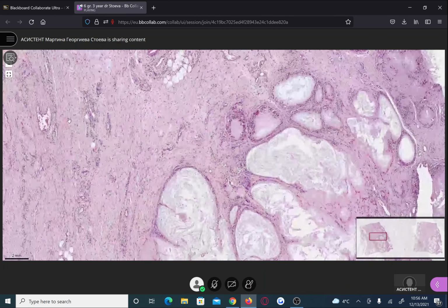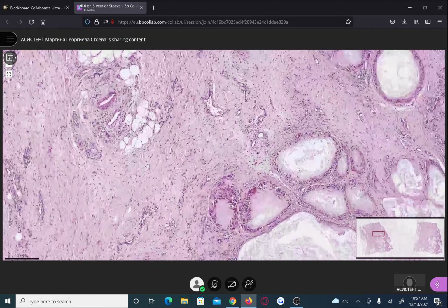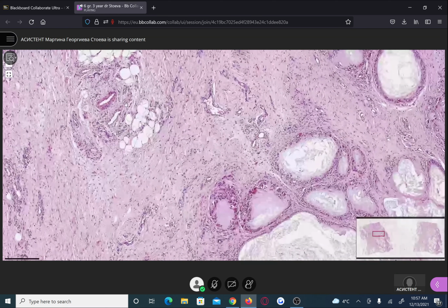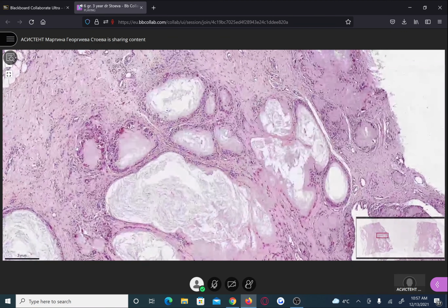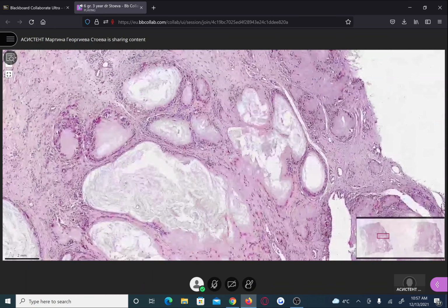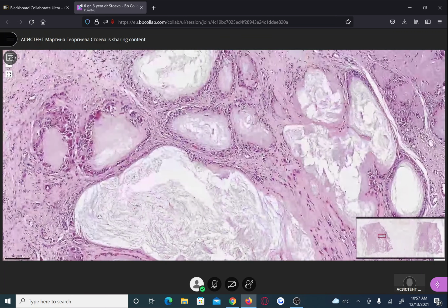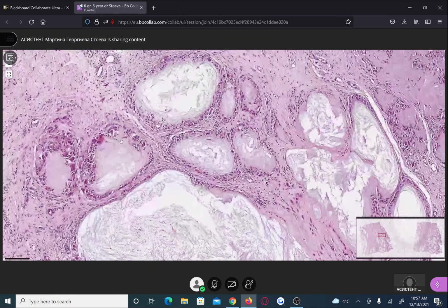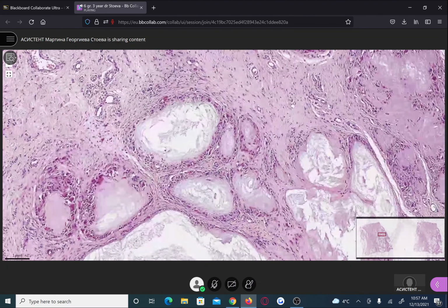After you mention that the specimen is taken from soft tissues because of the presence of connective tissue, adipocytes, and blood vessels, then you concentrate on the appearance of the granulomas. These granulomas are foreign body type because the uric acid deposits are foreign to the human body. They shouldn't be in the soft tissues. That's why the organism recognizes them as something abnormal, something foreign, and sends inflammatory cells to limit these deposits.